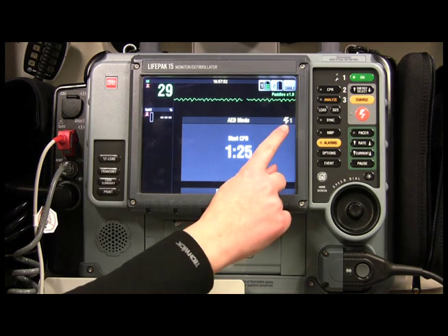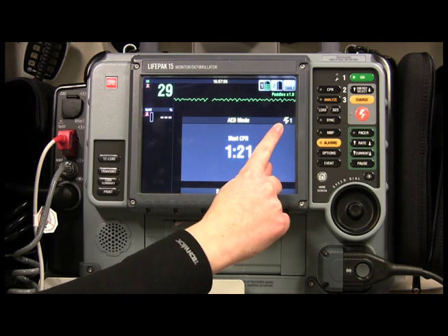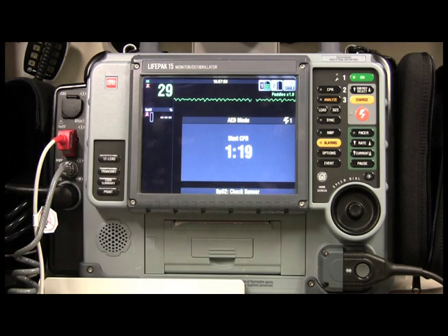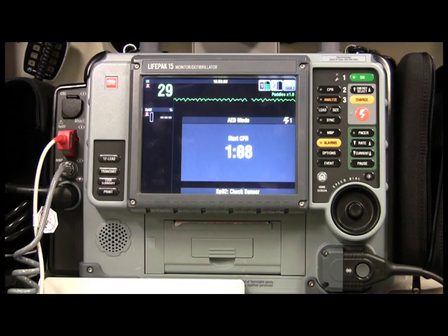Also, it tells you how many shocks have been given — so far we've only given one shock. And that's how you work a cardiac arrest. Once this countdown comes down, it's going to ask you to reanalyze. This is the point at which you check for a pulse and all that, then hit the analyze button again.